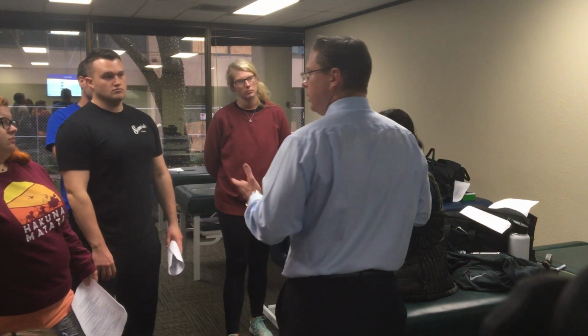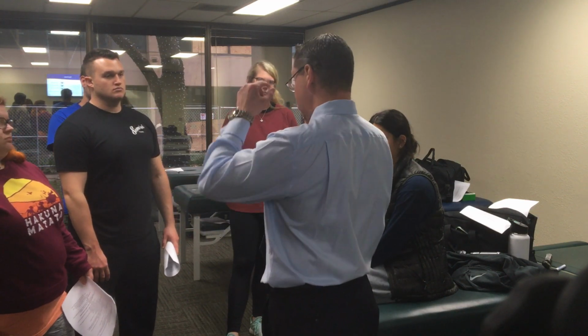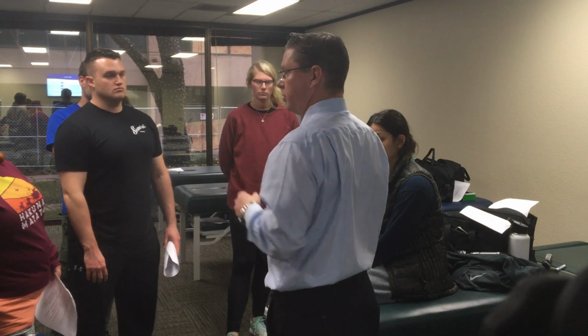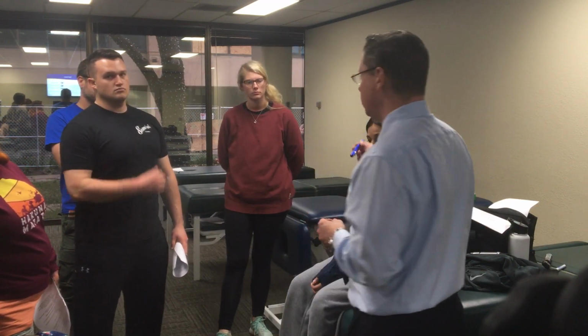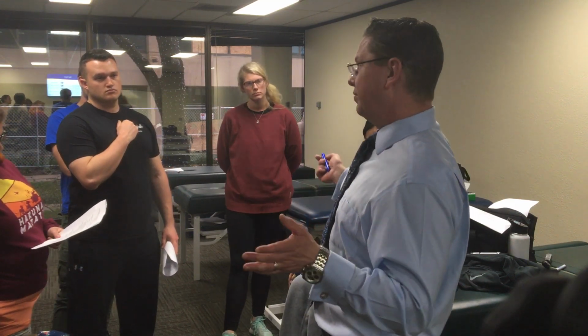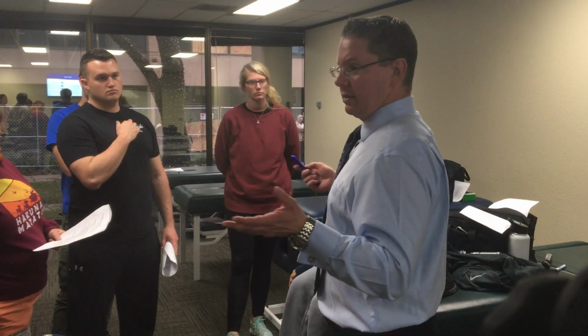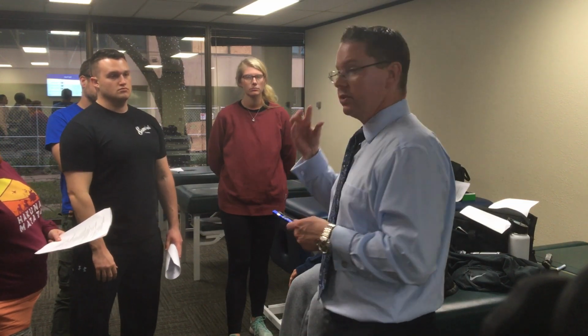All right, now what we're gonna do is get in our groups again. You'll check adequacy of closure, check for obstruction of the nasolacrimal duct, and then perform direct, tangential, and oblique lighting. And in here, we've seen cataracts in a couple people, so take a look and see if it looks black when you shine that light in or if it's cloudy or gray.